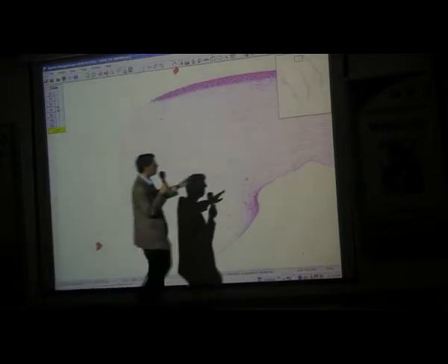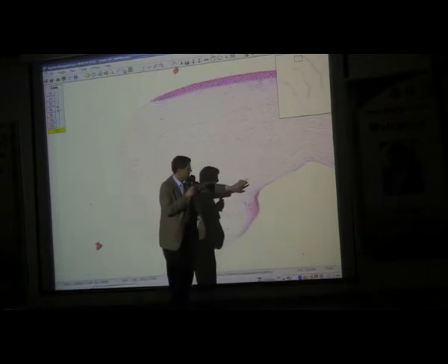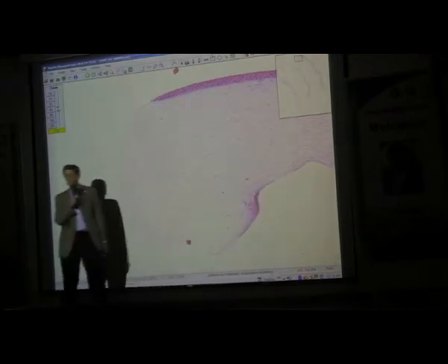And here's why. On almost every cornea that I will show to you that is done with penetrating keratoplasty, right? If you wanted to do DSEK and the reasons that it works and everything like this, that's a whole morning. But in penetrating keratoplasty, can you think of a reason that the periphery is always edematous? You see, if I look in over here, let me show you something. If I go up to the screen and look over here, do you see the clefts? You do. But as you get to the periphery, the clefts are gone.